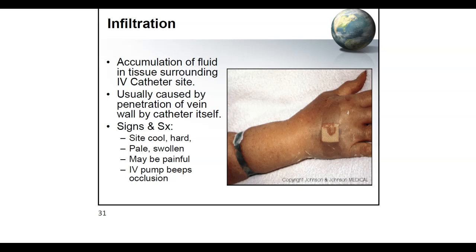And then the IV pump, it depends. Sometimes it doesn't, but for the most part, if there's enough pressure, it will cause the IV pump to alarm, basically saying occlusion, depending on what type of pump you have. But it will at times warn you that something else is wrong. As you can see, this patient had an infiltration. The hand is quite puffy. Look at this. And then obviously they removed the IV because once it's infiltrated, you can't continue to use it. So if there are any signs and symptoms of infiltration, please don't continue to use it. That's really torturing your patient.